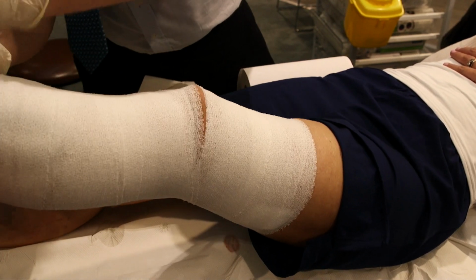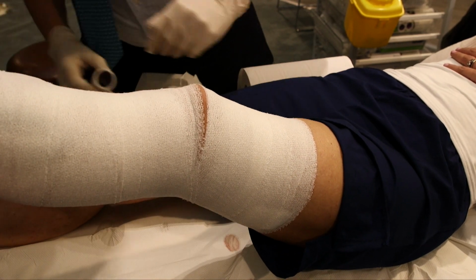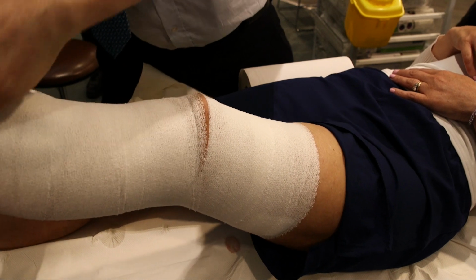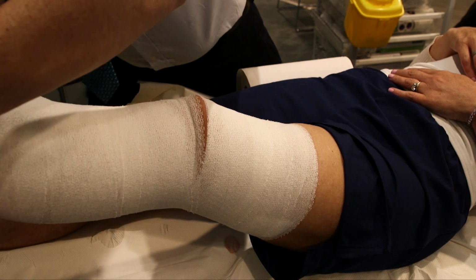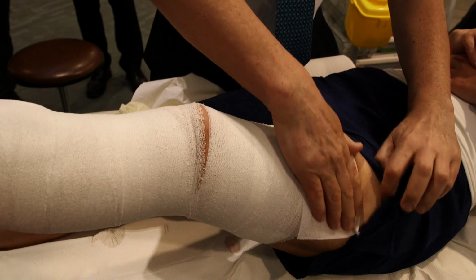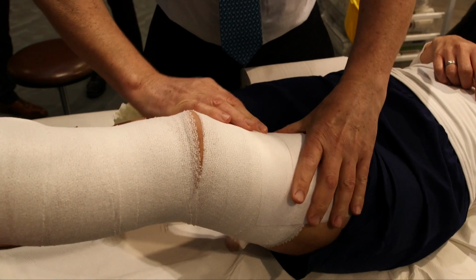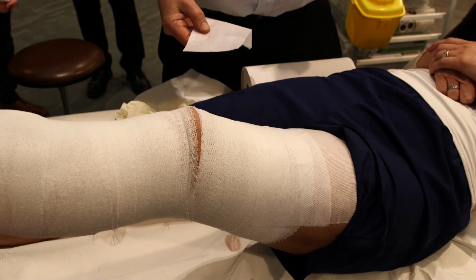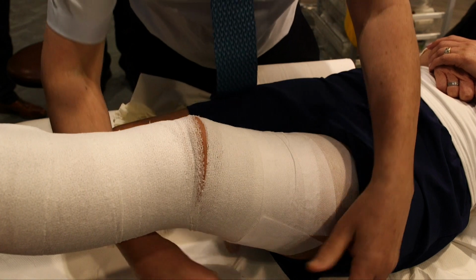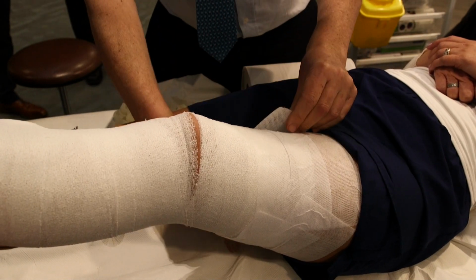Thanks. So that's a bit of Medipore to stick the bandage to the leg. And we're going to stick more of this to the leg up here. How's your leg feeling? Is it okay? It's quite achy here. Achy is good. That's the vein feeling sorry for it still. Fine. I encourage my patients to think of that as the feeling of healing, aching in the leg. But it only goes on for 10 minutes in general. It normally goes away. It usually stays away. Occasionally it comes back, and if it does, Nurofen is good if it's troublesome, or paracetamol. If you can take either of those things, it's fine.